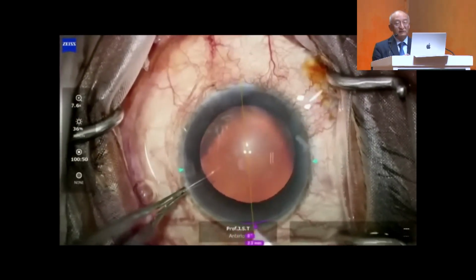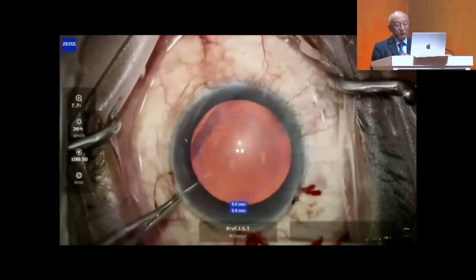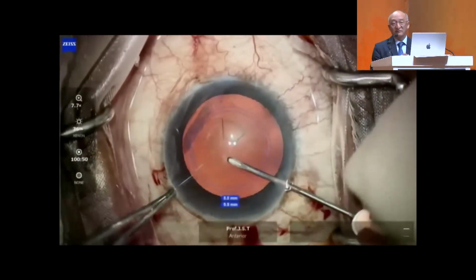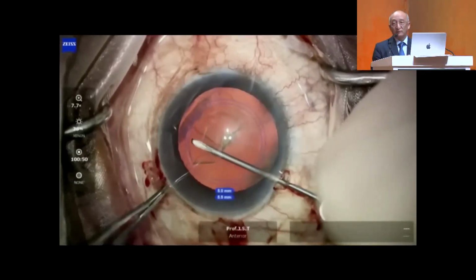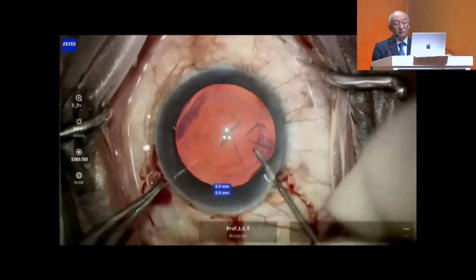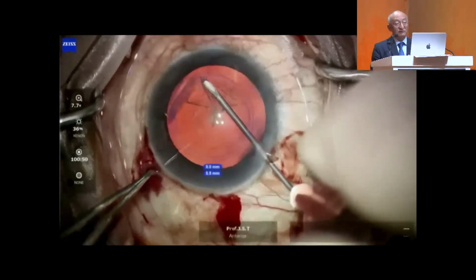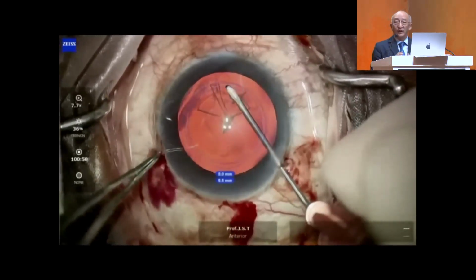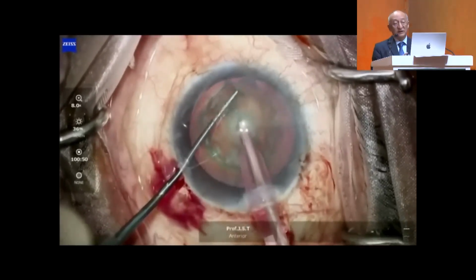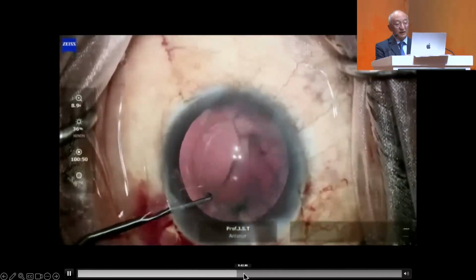So this is an image-guided surgery which I am showing, which gives you a regular area of incision always, and also gives you a guided rhexis orientation, so that the effective position of the lens can be placed better. Because it is important to have uniformity in making the rhexis also, and these guidelines are always better. Many of you may be doing a marking on the cornea, and that also can be satisfactory. Surgery should be simple so that you don't damage the posterior capsule.